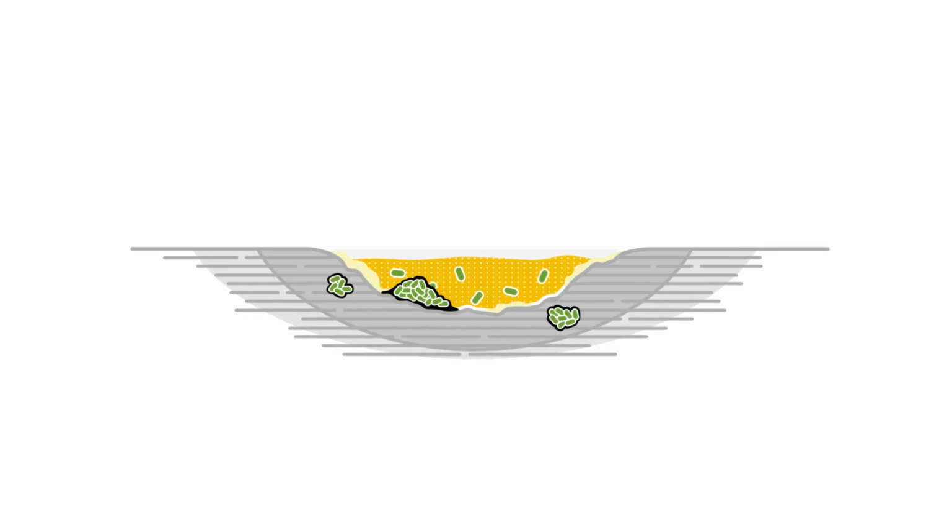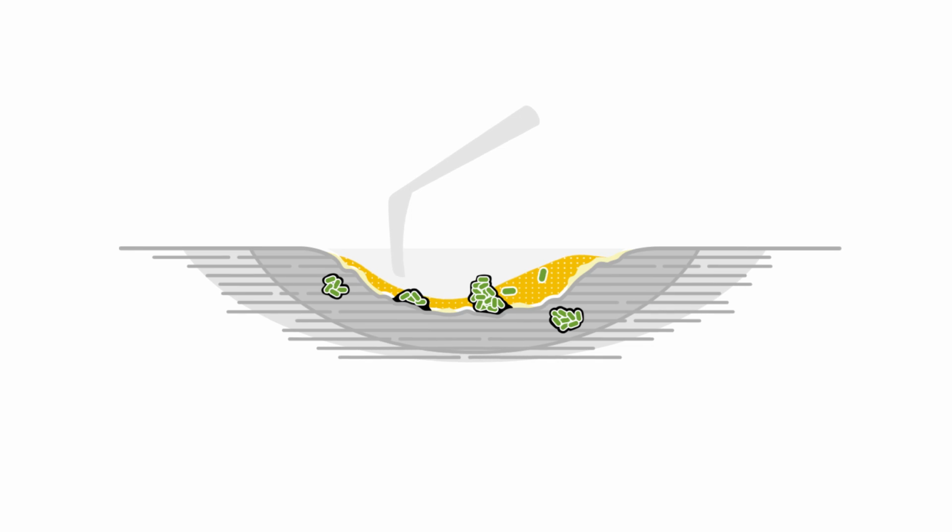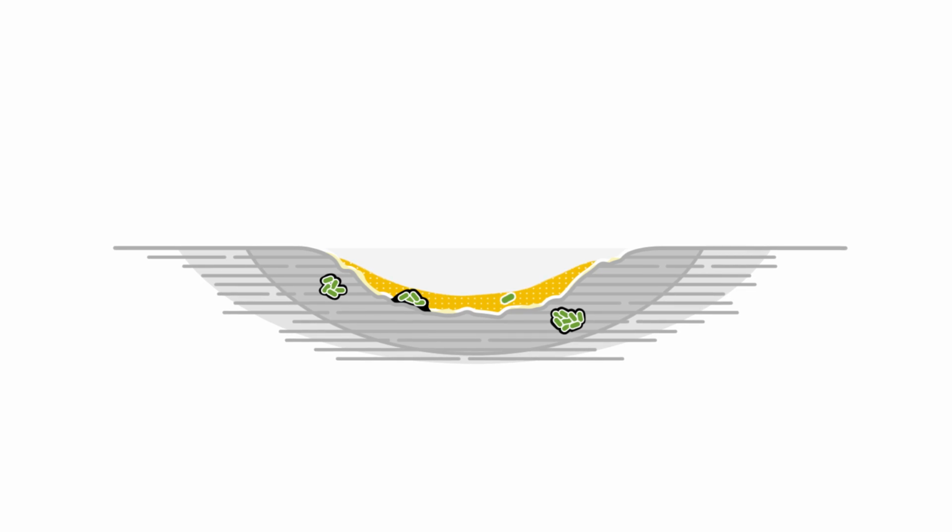New research shows that biofilms can be found everywhere in the wound environment, both in the surface of the wound bed but also in the tissue below the wound bed. The presence of biofilms can lead to infection, inflammation, and delayed healing. To promote optimal healing, it is best practice to first cleanse and debride the wound to remove slough and non-viable tissue. This will remove some, but not all, biofilms in the wound.